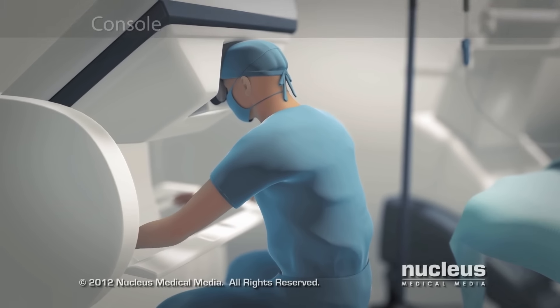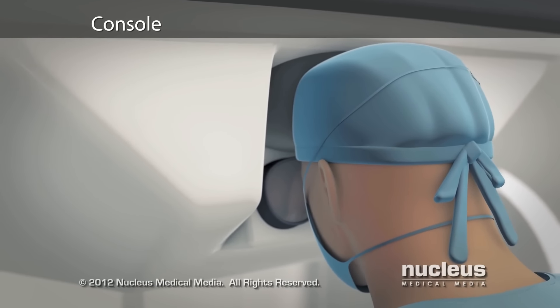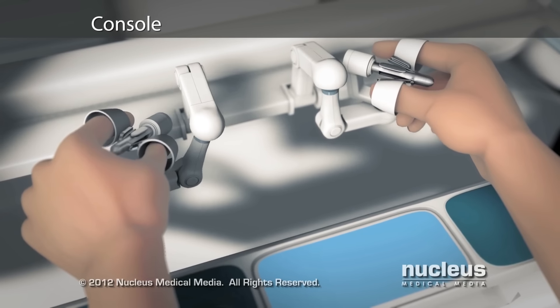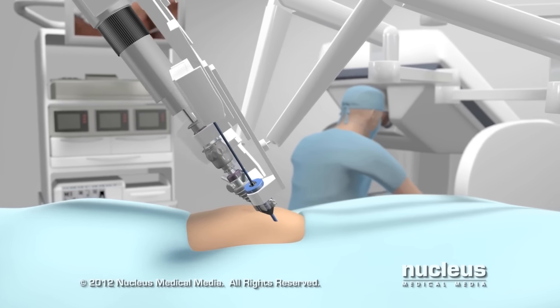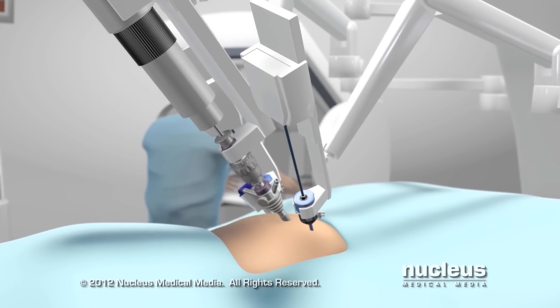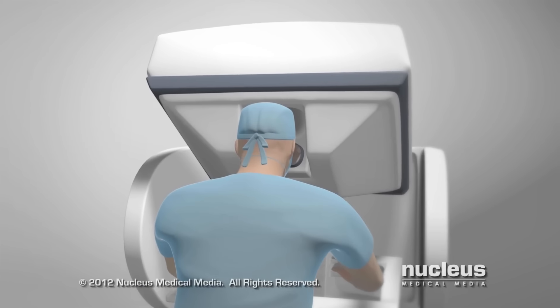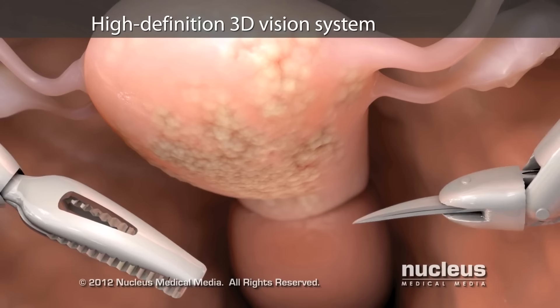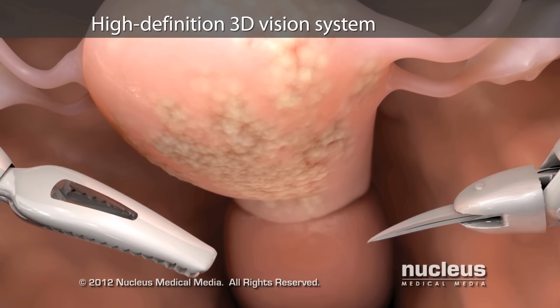Seated at a special console, your surgeon will operate the robotic arms and the camera with joystick-like controls and foot pedals. A computer will translate the exact movements of your surgeon's fingers into precise movements of the surgical tools. At the same time, a high-definition vision system will provide a magnified three-dimensional stereoscopic view of the surgical area.